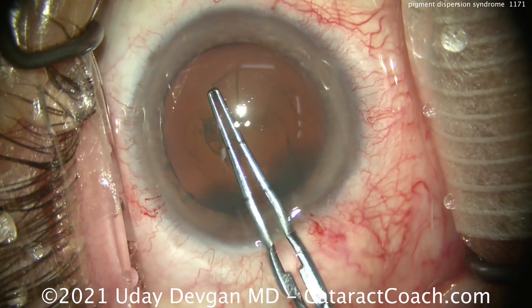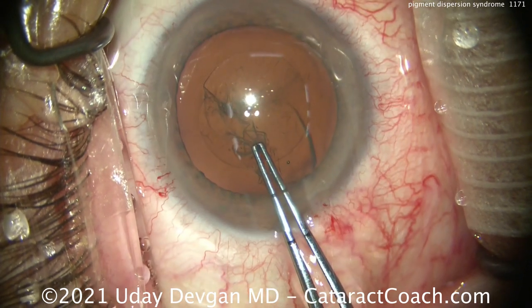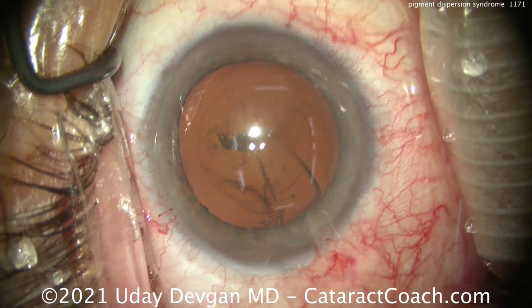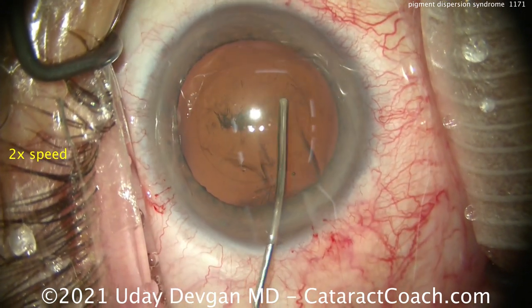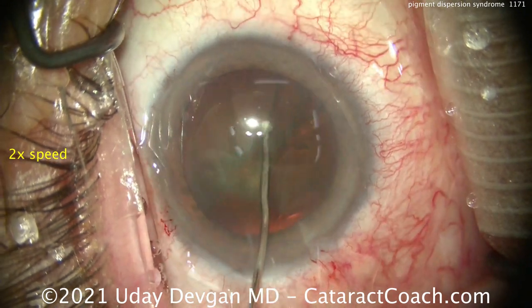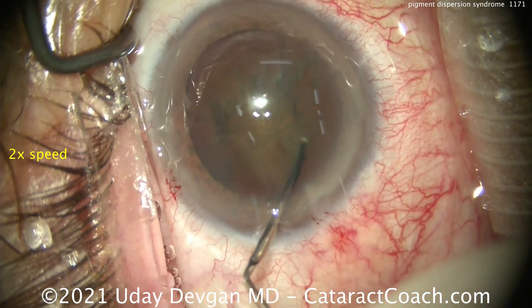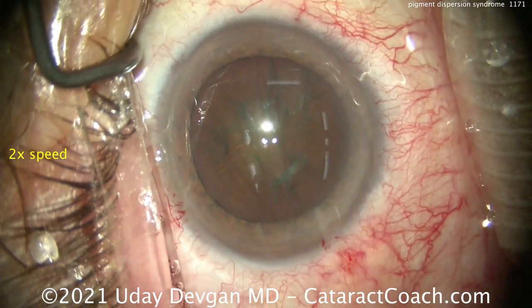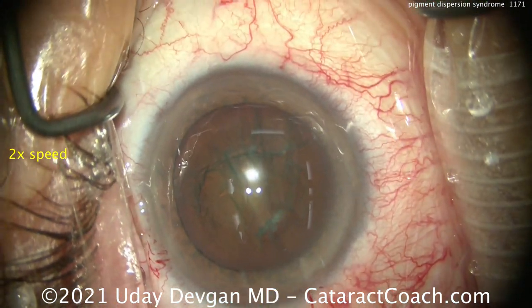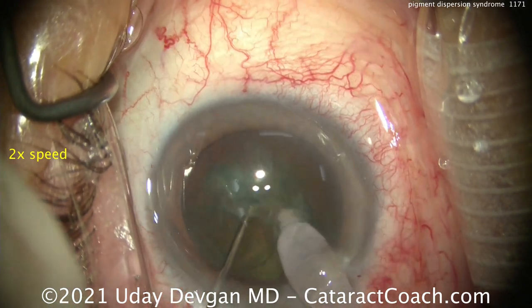We're taking out a thick human lens — more than 4 millimeters in thickness from anterior to posterior — and replacing it with a man-made lens that's very thin, only about 1 millimeter or even less. As a result, any scraping or rubbing of the posterior surface of the iris, which is what's been postulated to be the issue in pigment dispersion syndrome, is going to be resolved — that's not going to be an issue anymore.